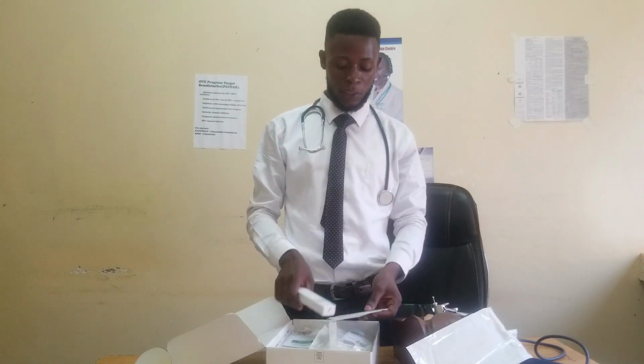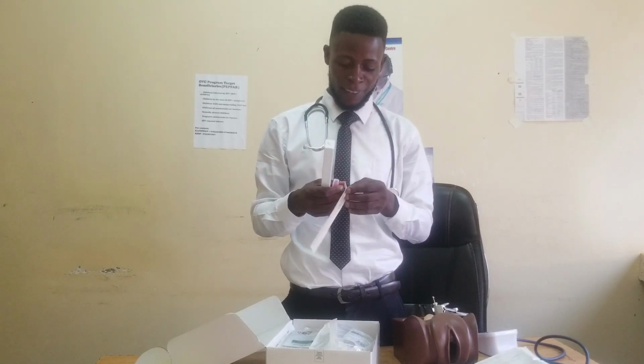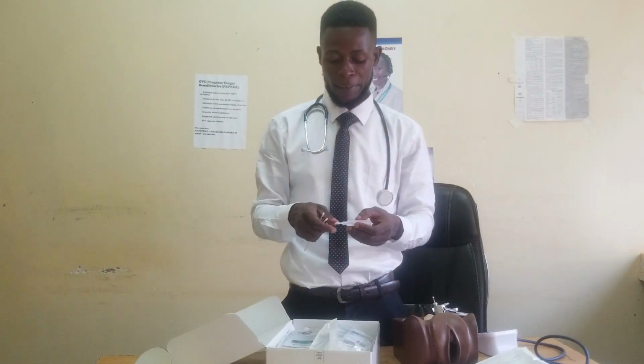So in case you see, you can swab. How do I swab? You always use this guide to remind you. You open. I'm sorry, I have very short fingernails. So you open, then you wet. Always open this one. If you have something to help you, place it somewhere to dry before you seal. When I open, I get my water, I wet.